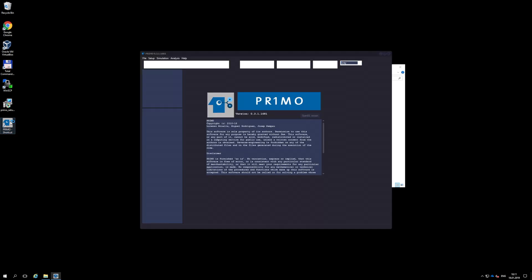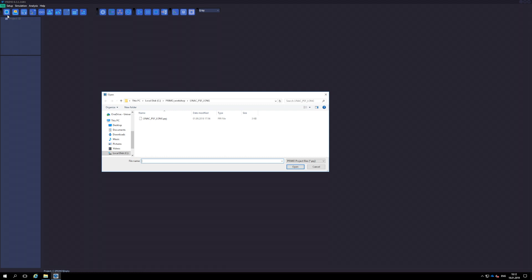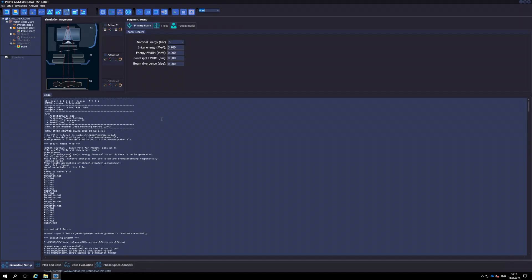We now launch Primo and load a previously computed project in which a dose distribution was tallied. The user must be certain that the simulation conditions such as field size, energy, and source-to-surface distance correspond with those used to acquire the experimental data.